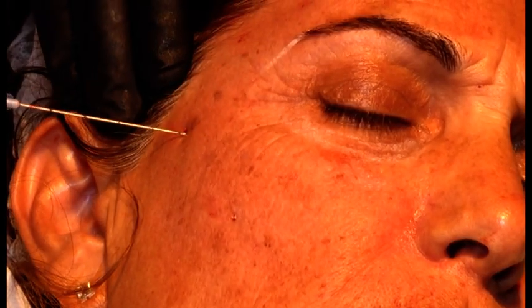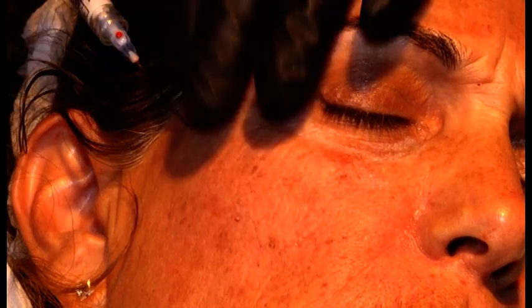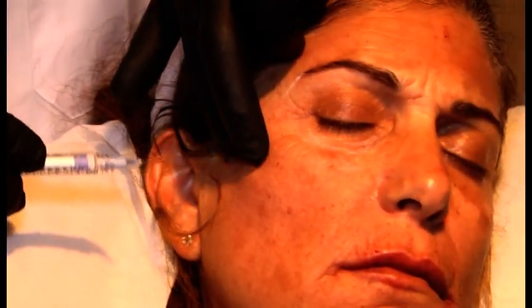And I can also do that from here, because it will give a little bit of volume, and a little bit of, let's say, transitional light reflection, because I actually like to have a little bit of shadow over here in the right vector, so in the right direction.